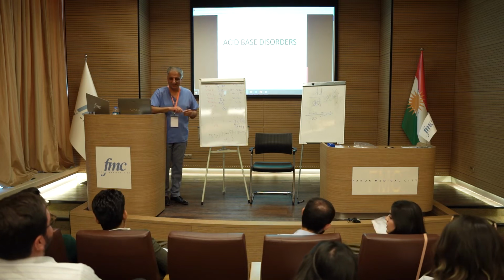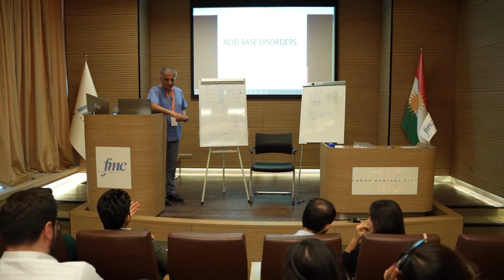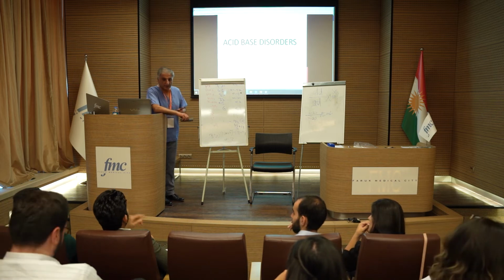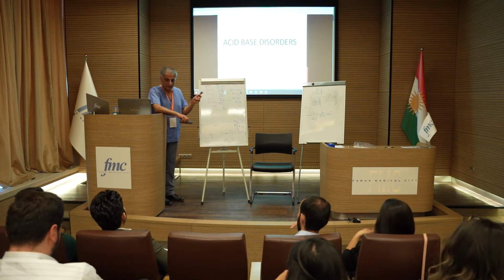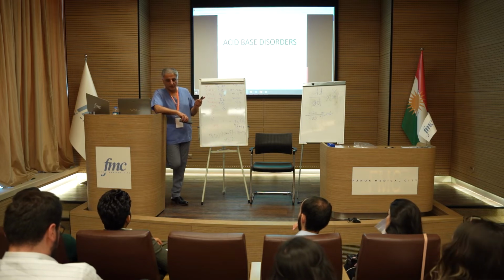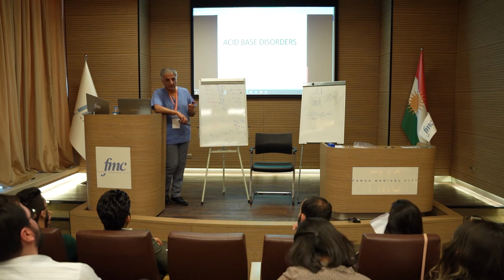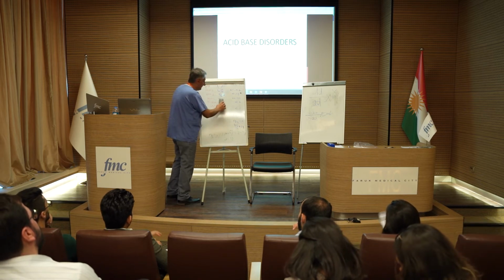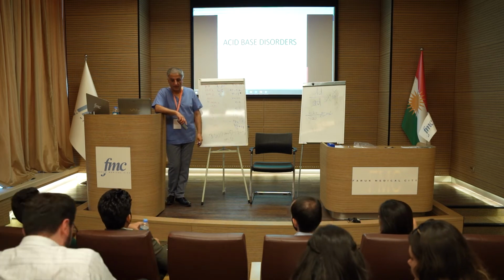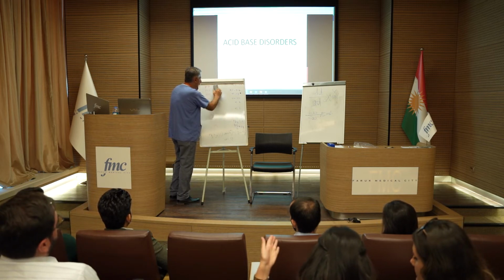I know it's not easy, but that's probably it. The elevated lactate will explain the situation, you mean? Yeah, the hypoperfusion, and the metabolic element of the acidosis. Because lactate is an acid, and lactate comes from hypoperfusion or sometimes liver dysfunction, but hypoperfusion in the majority of cases. If lactate was normal, then we would have thought about a respiratory cause. It's very tricky.